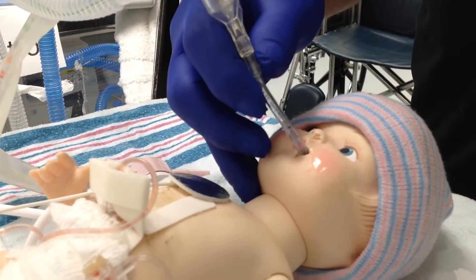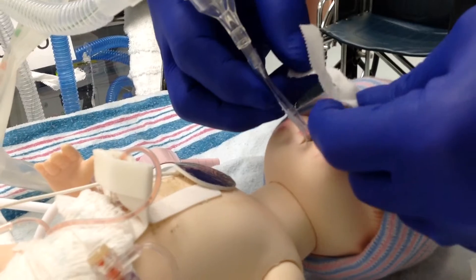You then can take your hand and wave it at the baby's face just to dry the mastosol before the tape goes on.